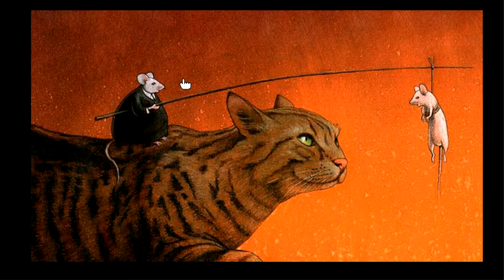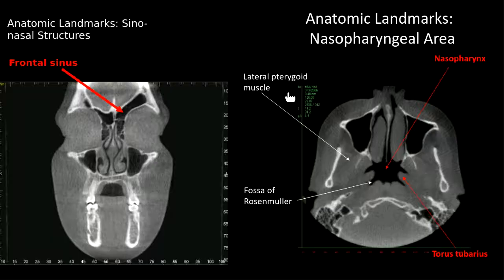Now it's interesting, if you miss any tooth-related inflammation or any tumor, any cyst, you're responsible for that. So make sure you know and see. If you don't know, ask for help, and we will come and help you. Otherwise, somebody else will catch you, and we don't want to put our colleagues in an embarrassing situation.